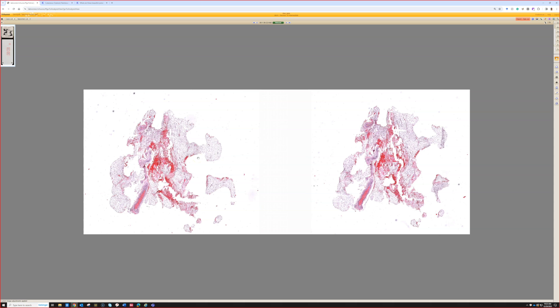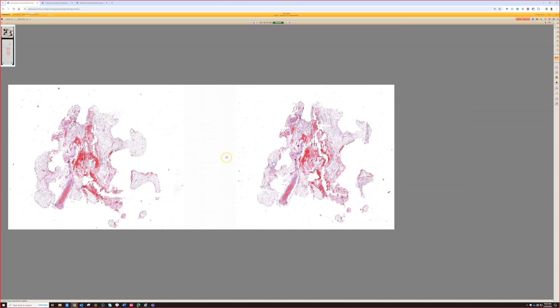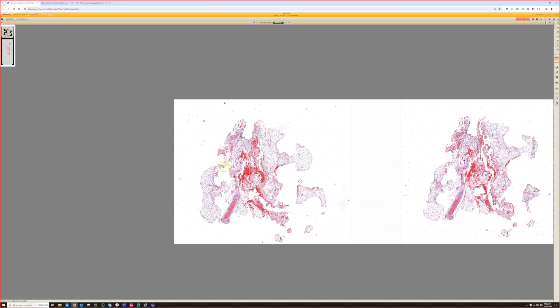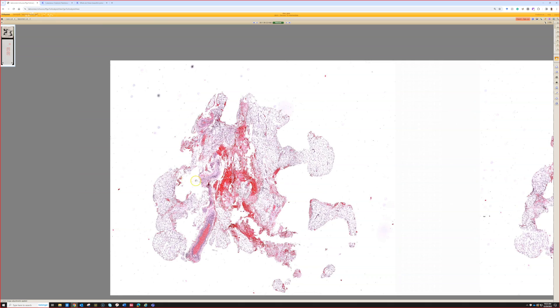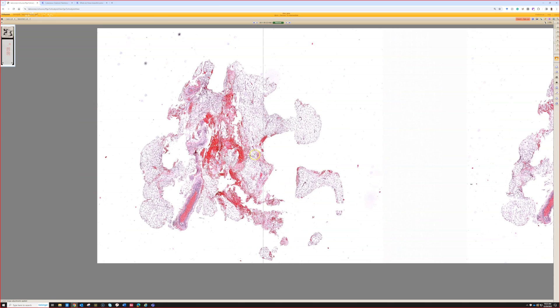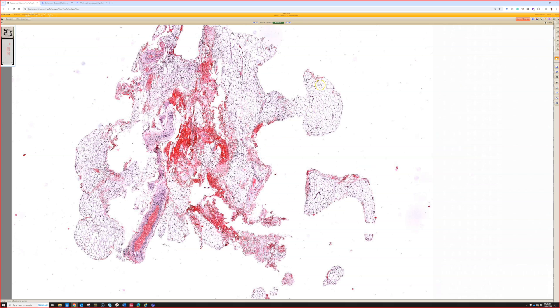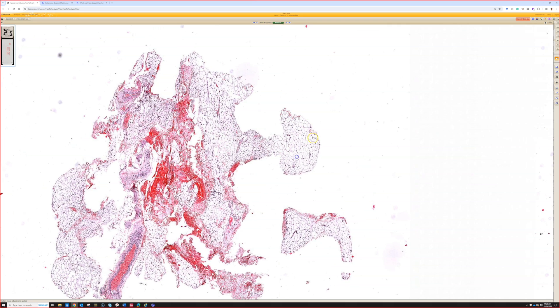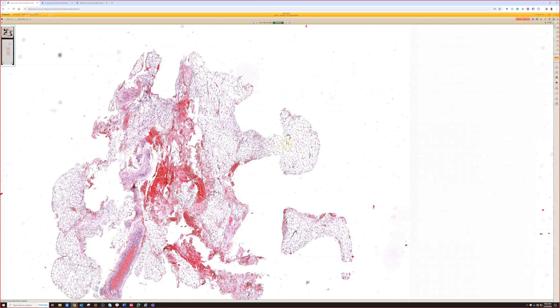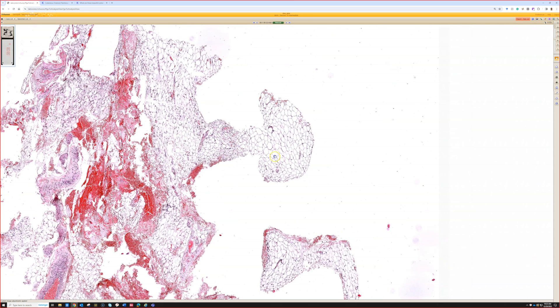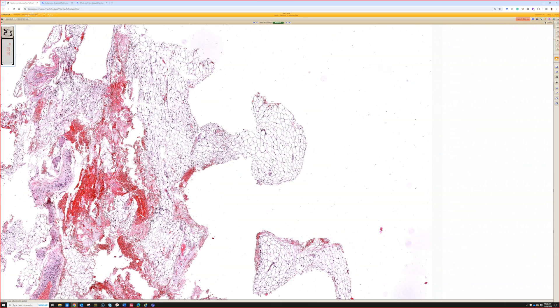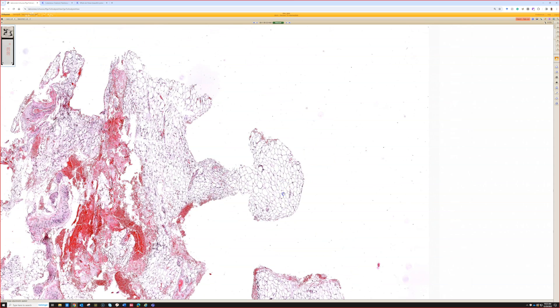Now this is case 29, the final case. This is subcutaneous fat with no skin over it. It's a fat pad biopsy when there is a clinical suspicion for amyloidosis, systemic amyloidosis.